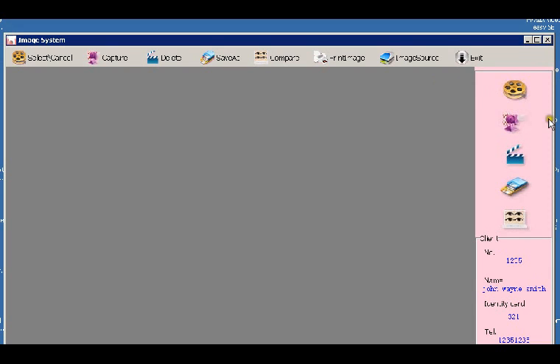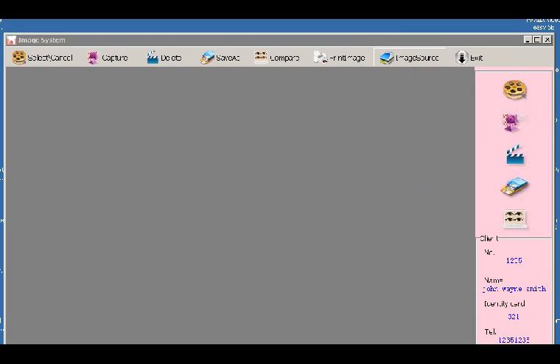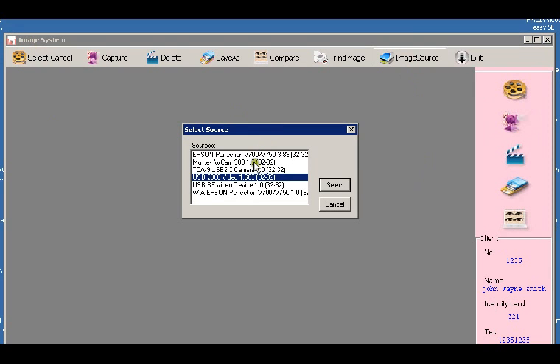The first thing you can do is go and select the image source. You can see it comes up with a number of different webcams, digital cameras, etc. installed on my system. I'm just going to select the little Digioden, which is that USB 2800 Video 1 device there.